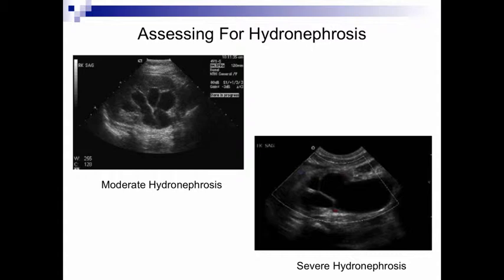The way you can give yourself a clue, and as a good practice to have in general when imaging the renal tree or any symmetric structure, is image the other side. So polycystic kidney disease, the other kidney will look the same. You'll be like, this is probably not severe bilateral hydronephrosis unless they have obstruction at the bladder or below, essentially. Or it'll be asymmetric in appearance, which will confirm again your clinical suspicion that they have unilateral hydronephrosis on that side.